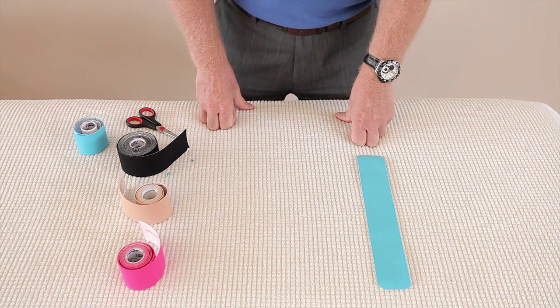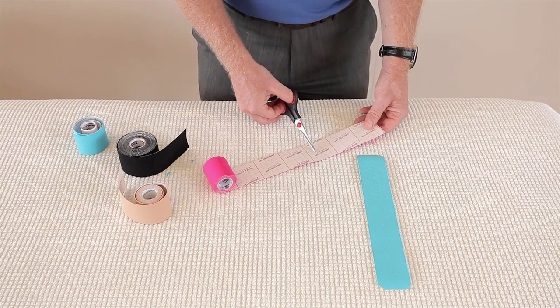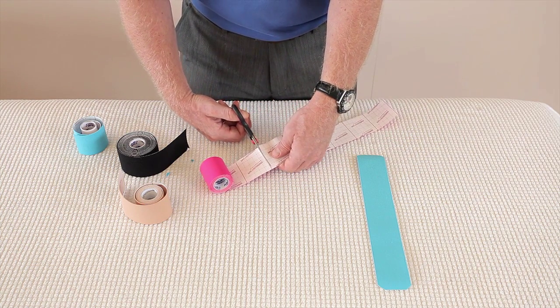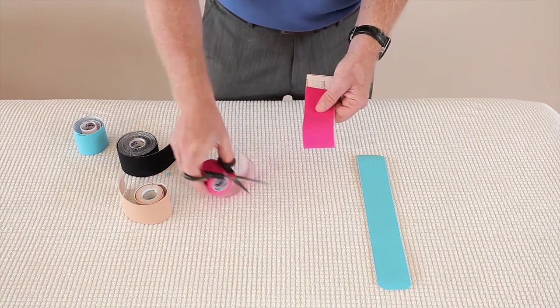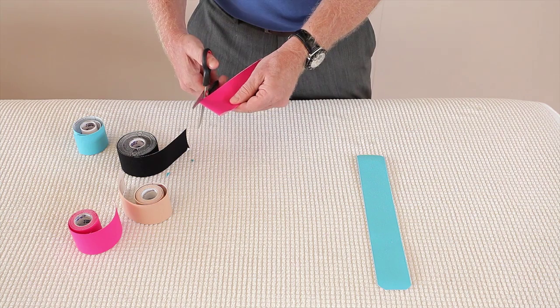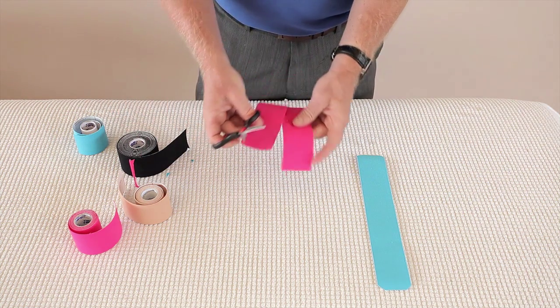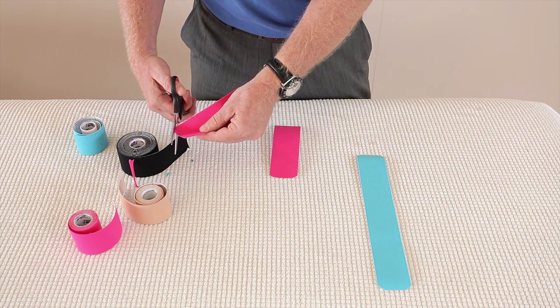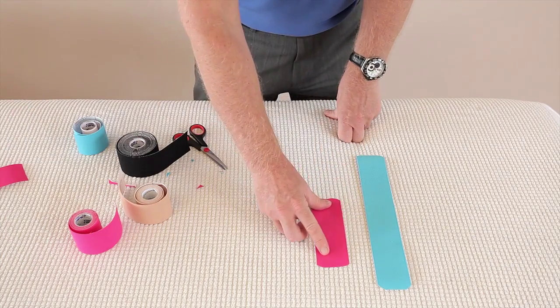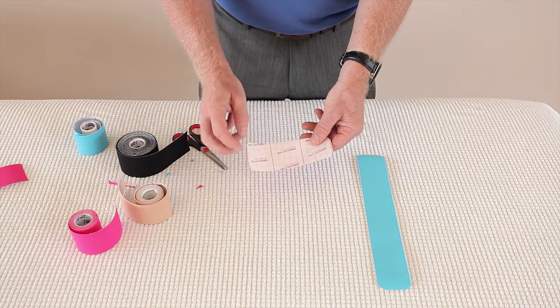Now we're going to do a smaller eye strip. I tend to use 3 squares, but it takes time to prepare each part. So if I cut this into 6 and fold it in half, and literally just round the center part, then we have 2 standard eye strips. I can round off one of them, and that's now a standard small eye strip. You'll notice that it's 3 squares. In some of the videos I might be using 2 and a half, so you just make it a bit smaller.